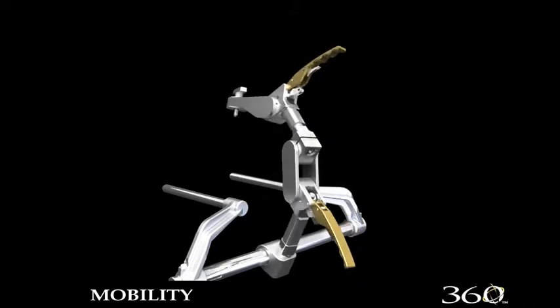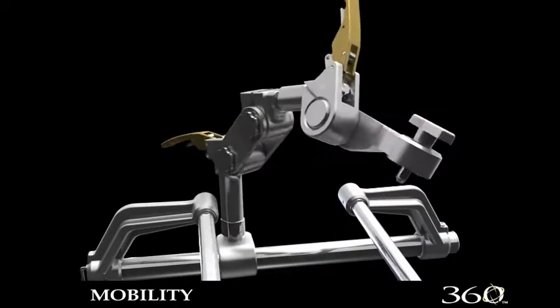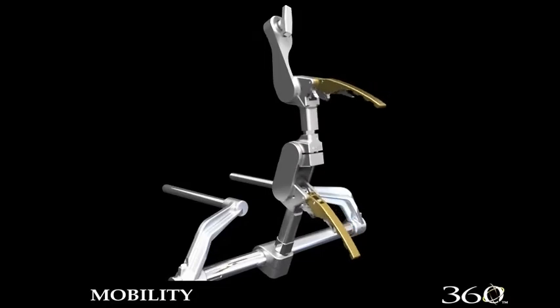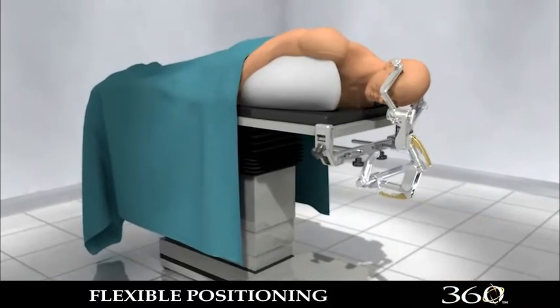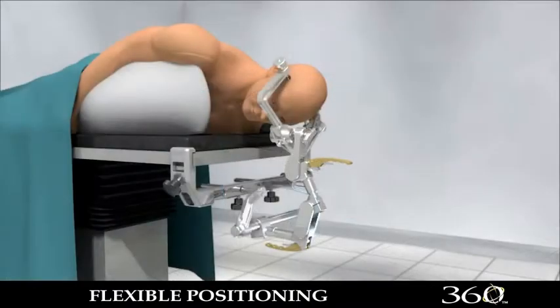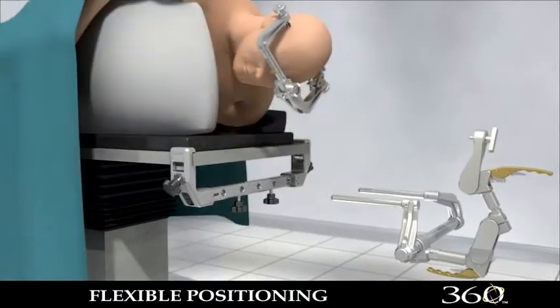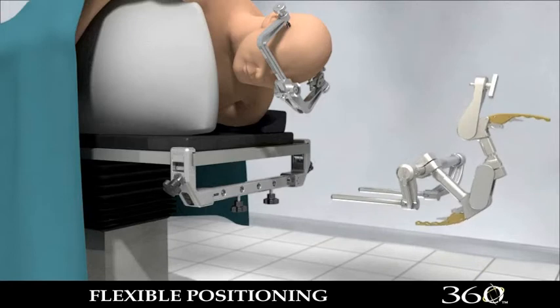The new 360 is not confined to only lateral movement. It can now rotate in many planes so it can move exactly where the neurosurgeon needs in order to position the patient. The 360 can uniquely address the patient who is positioned laterally and is difficult to reach because of the patient's size and superior head position. The 360 can be turned upside down for attachment to the OR table, providing additional reach for attachment to the Mayfield skull clamp.